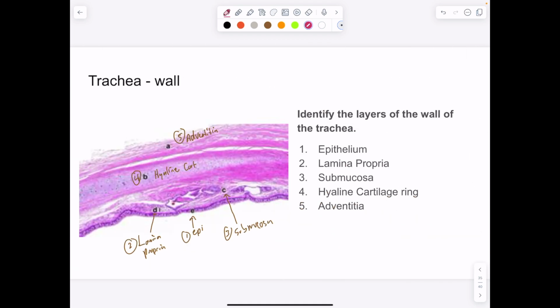All right. So now it's time for the lab review that comes to the lab guide. We go back to our trachea. We also think to ourselves, we love the trachea. Why? Because it's that thick, fat basement membrane, which is right here.